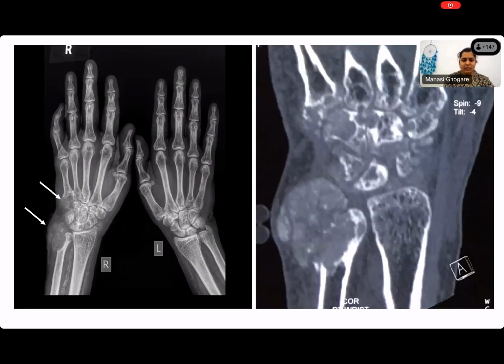Very good. So you saw, I think I also shared the radiographs. One minute, Mansi. What's on the left-hand side and what's on the right-hand side of the screen? On the left-hand side is the X-ray, and on the right-hand side there is a CT scan. Why do you say that's a CT scan, Mansi? The appearance of the lesion, the appearance of the soft tissue. All right. Mansi thinks it's a CT scan, and on the left-hand side, you think that this is a plain X-ray, right? Yes, ma'am.